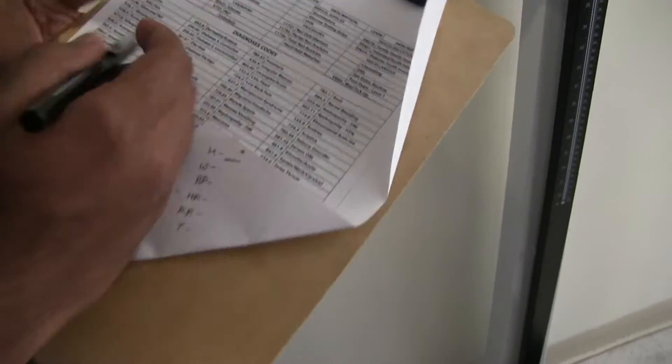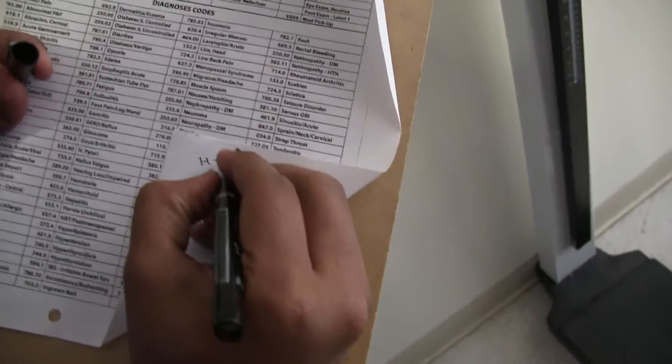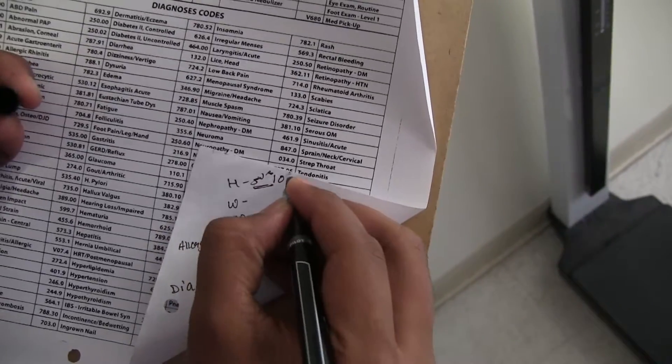So in your chart you'll just write down, for height just write down 5, 10 inches and then you can transfer it later.